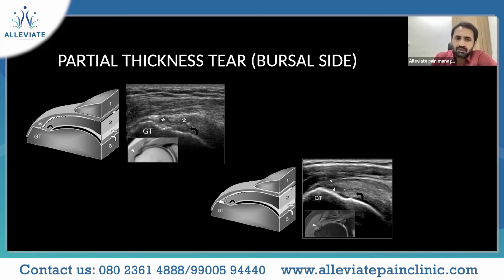Here you can see a partial thickness tear on the bursal side. What you should know is there can be a bursal side tear, an intrasubstance tear, or an articular surface tear. In this, the one is the acromion. The arrowhead is your subacromial subdeltoid bursa.